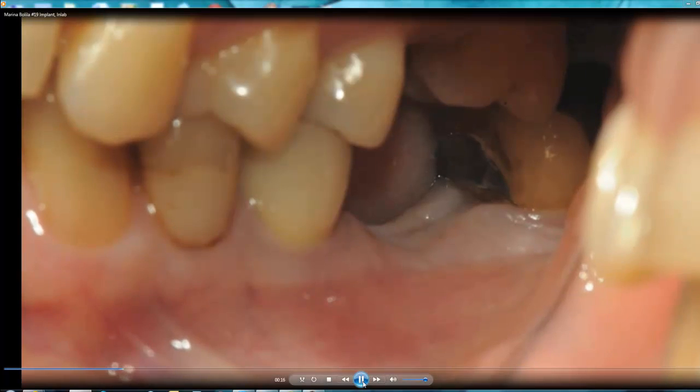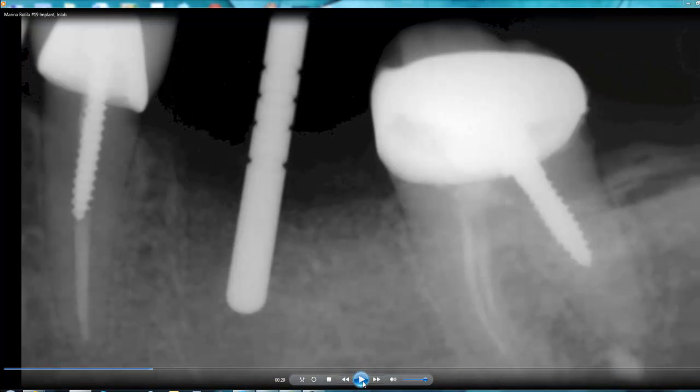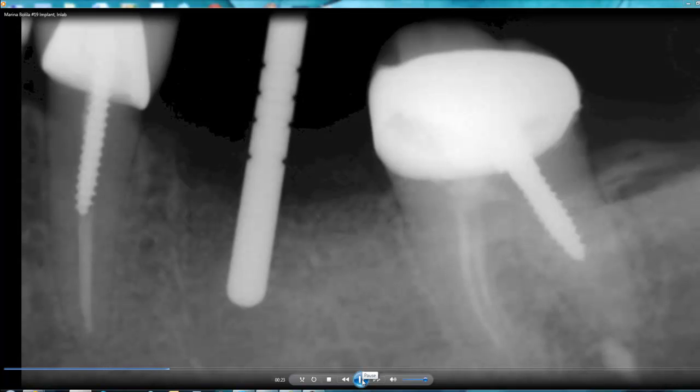When placing the implant, I want to make sure that when I put the pilot drill in, I take my initial x-ray. I want to confirm from the restorative point how my implant is going to be placed and how my crown will be designed. So I design my crown, look at the final restoration, and then start the osteotomy to place the implant. The initial x-ray is taken and the MIS implant is placed.